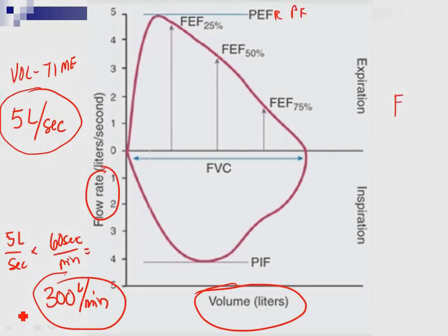Now notice we not only have the peak expiratory flow, we have the peak inspiratory flow, where this is an expiratory maneuver, this is an inspiratory maneuver. So take a deep breath in, blast it out hard and fast, push, squeeze, keep going. Now take a deep breath in.